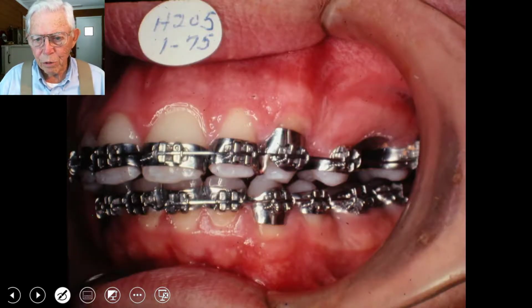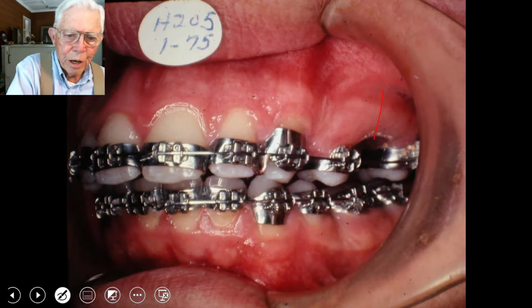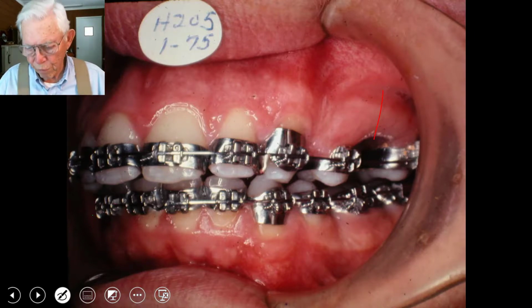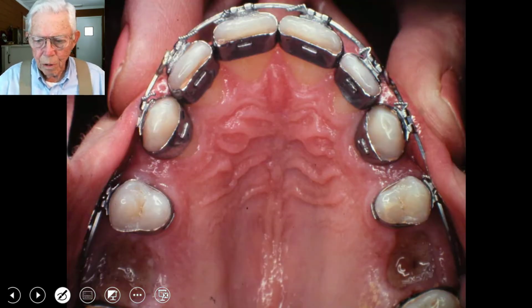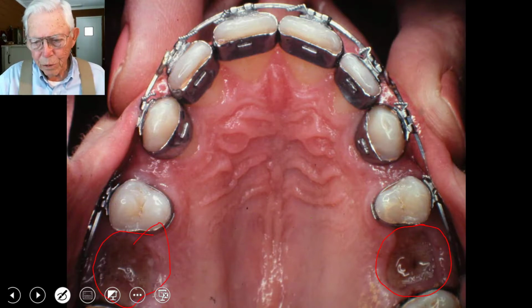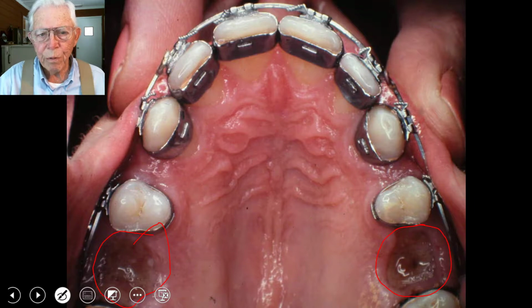We'll come back and do the 6-year molar extraction. Now they've been done. Now, these teeth are out back here. I'm going to show all of this on X-ray in just a few minutes. Those are out. Now here we've got the molar extraction side. And so you're pulling the lower molars, the upper second molar, and making room for the upper wisdom tooth to come in to fill in that place, and we'll close this together.